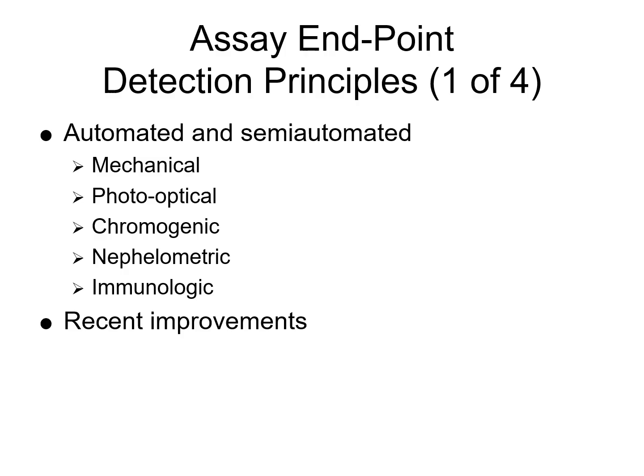For chromogenic, this uses substrates that release a colored product when cleaved by a specific enzyme. The intensity of the color will correlate with the enzyme activity. Then we have nephelometric. This measures light scattering caused by immune complexes or particulate matter formed during the assay. This is used in immunologic detection such as fibrinogen or D-dimer quantification. Then we have immunologic. This detects specific antigens or antibodies via immunoassays, often using labeled antibodies for quantification. This includes turbidimetric and latex enhanced immunoassays for D-dimer and fibrin degradation products.